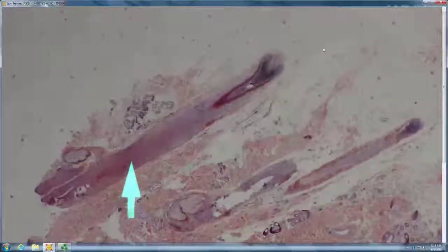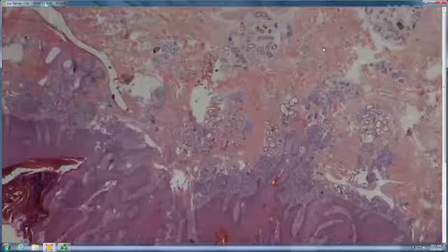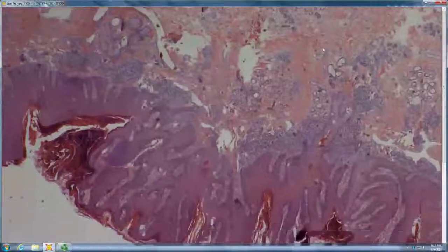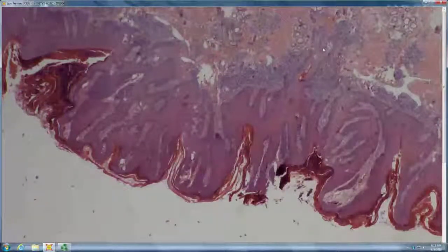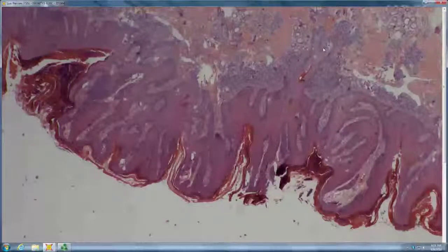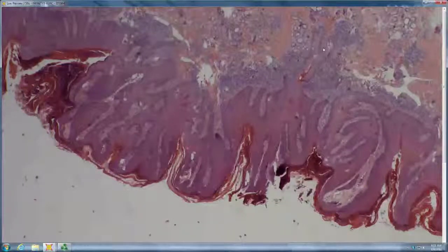Okay, how about this one? Where do you think you are? This is scalp again. I see plenty of sebaceous glands. Is the top flat or is it papillomatous? Papillomatous with apocrine glands in the dermis. So post-pubertal nevus sebaceous. So this is probably right around puberty, right?